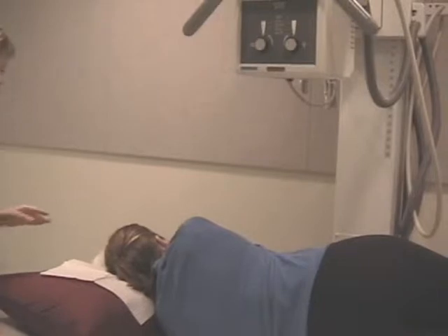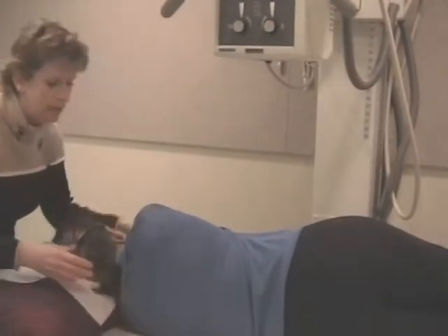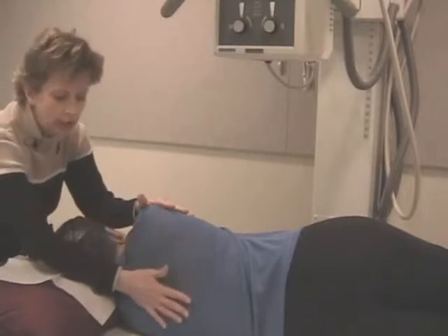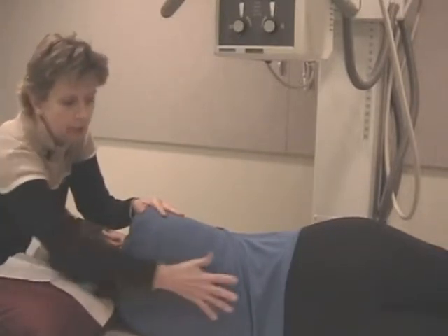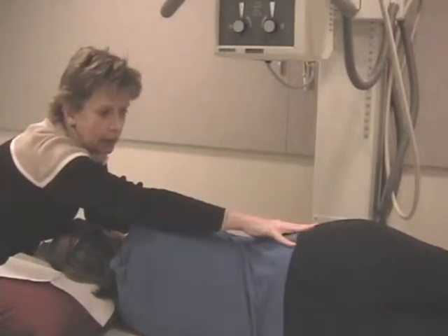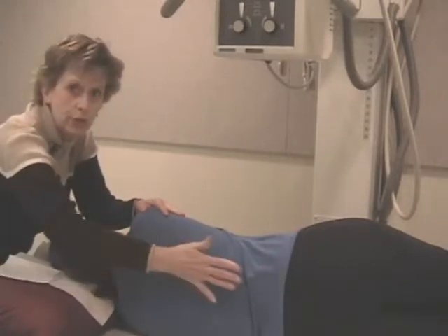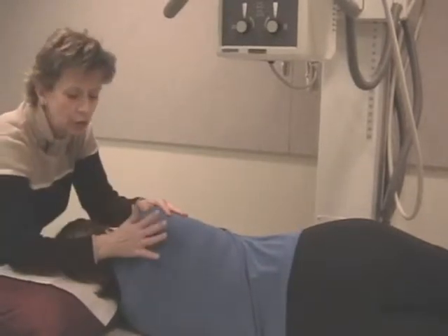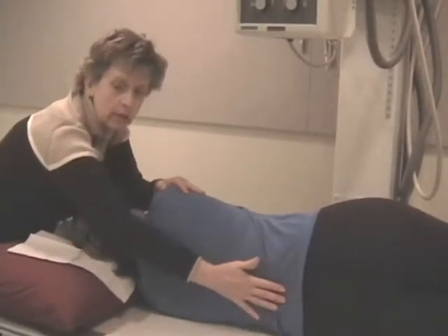I'm going to go to the head of the table, and I can see that she's crooked. So I now have her straight, and I'm going to look at the shoulders to see if they're straight up and down, and I'm going to look at the small of the back to get her into a nice, true lateral position. Don't forget, I want you to look between the shoulder blades, and I want you to look at the small of the back.